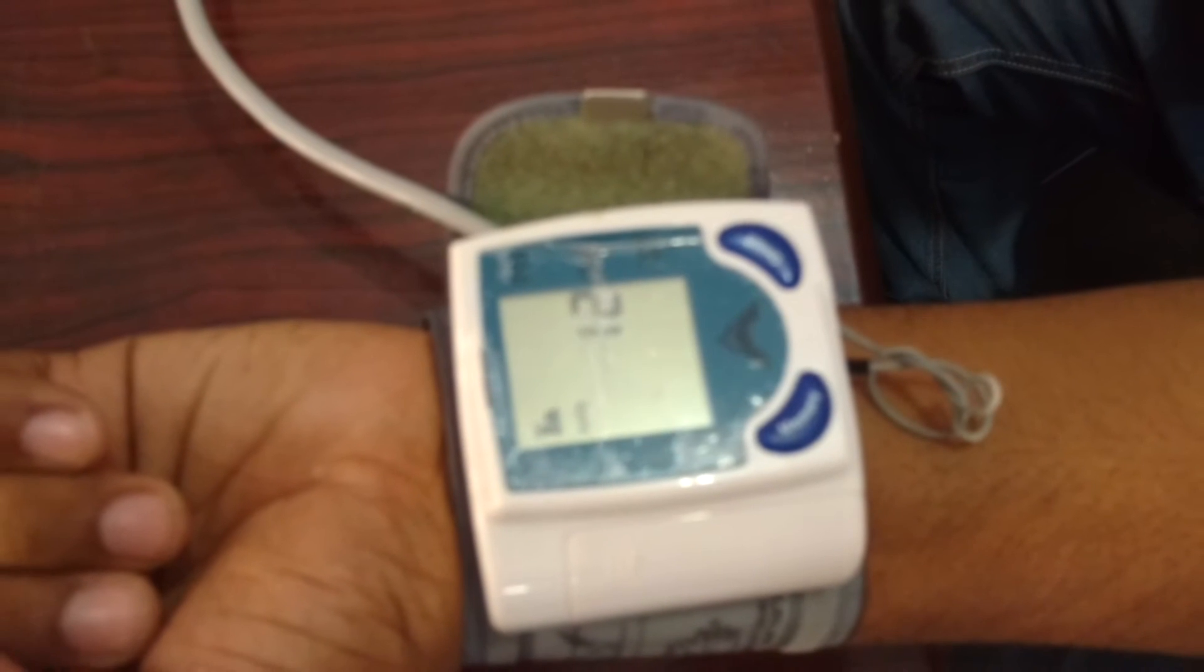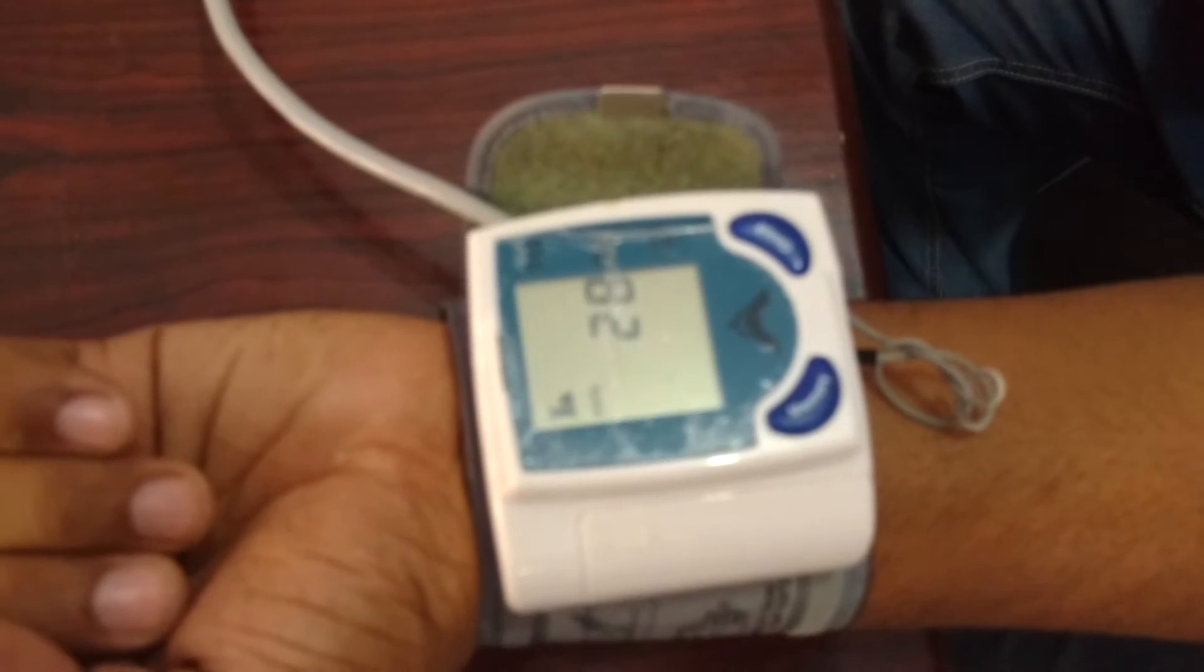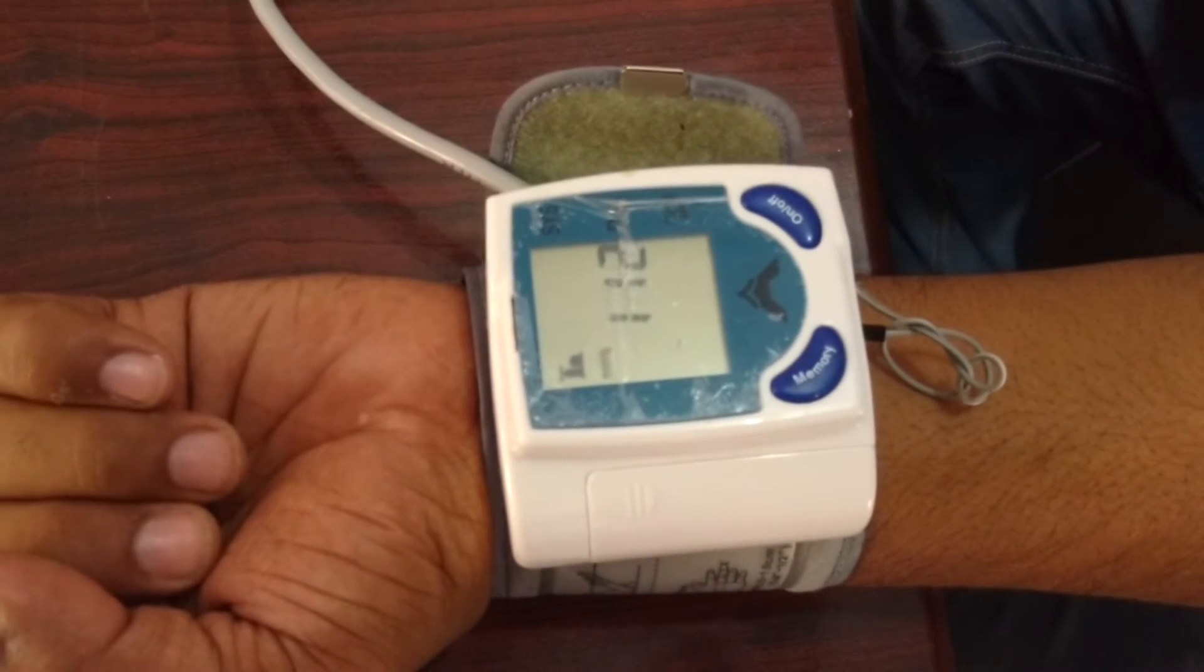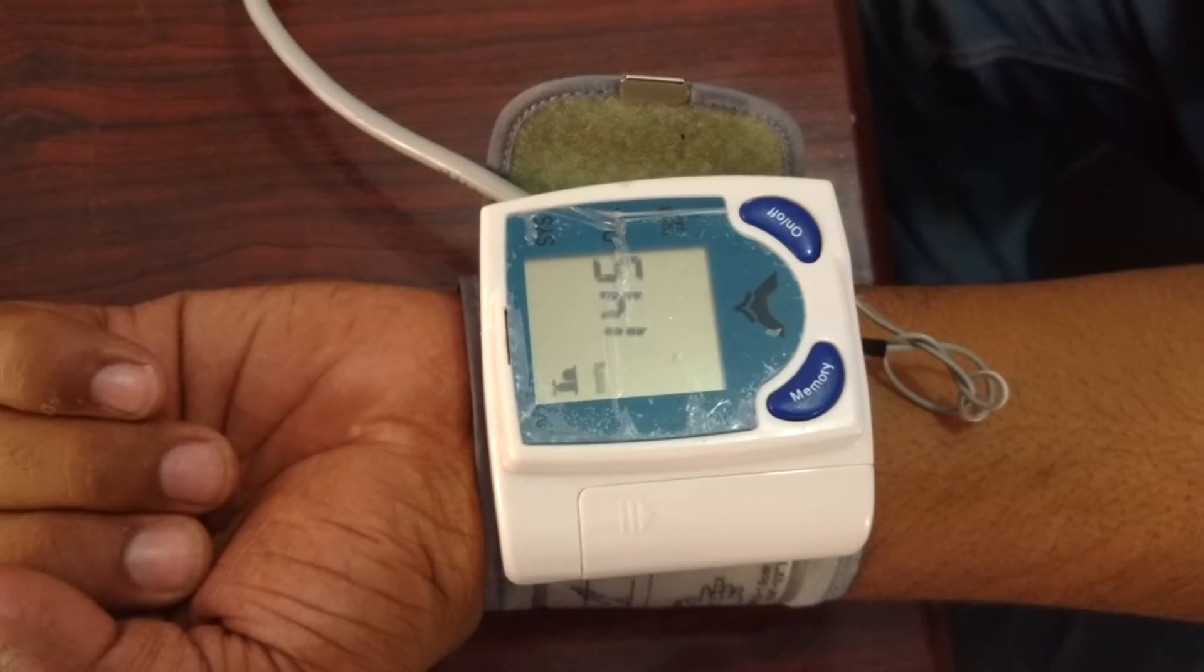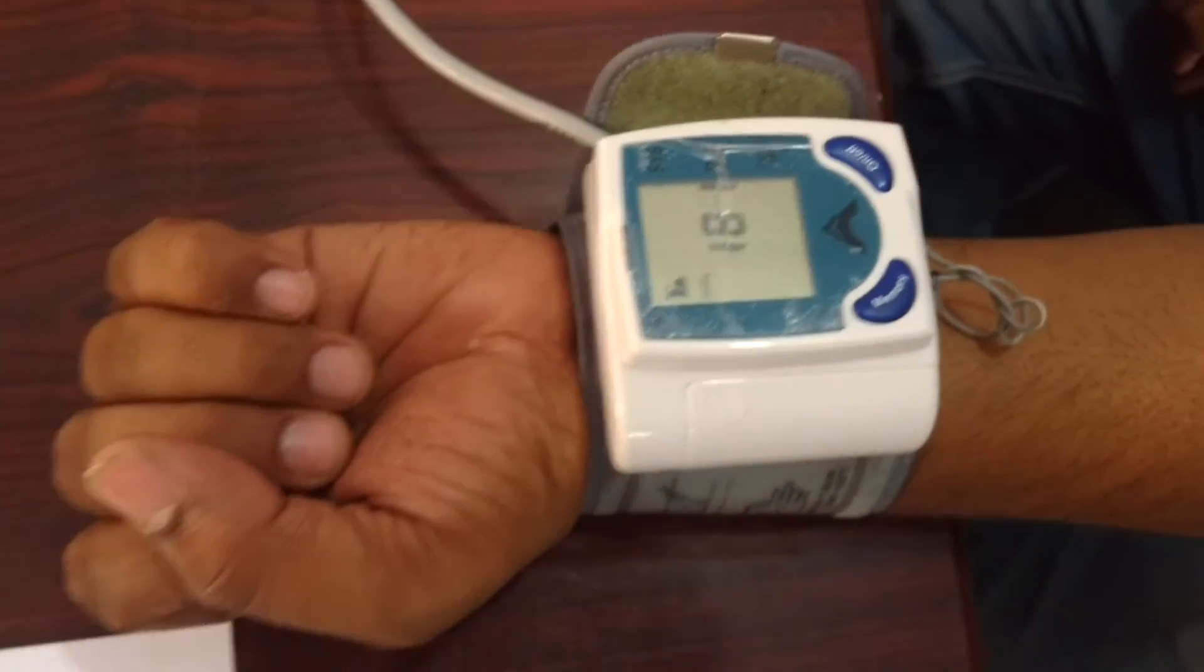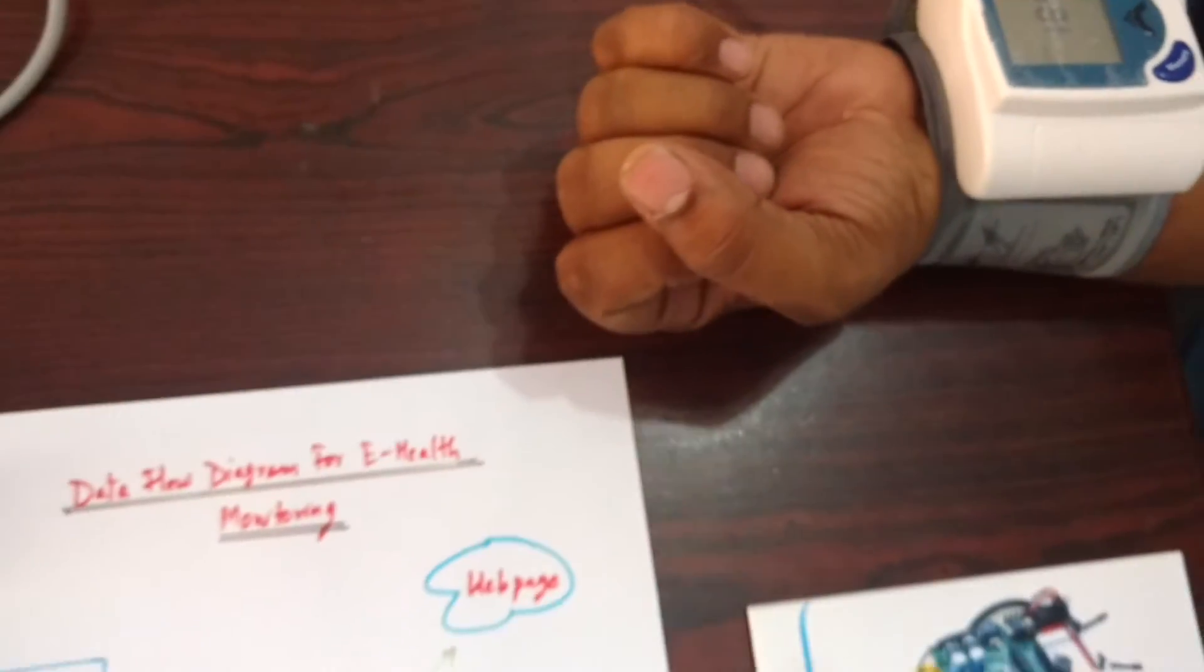As soon as we switch on the sensor it will start measuring the BP value and the same value is being transmitted over here.